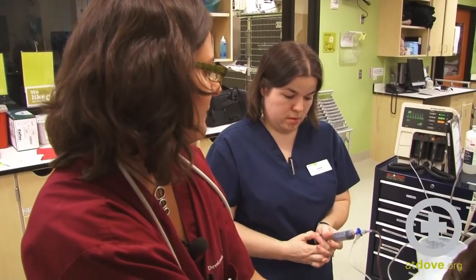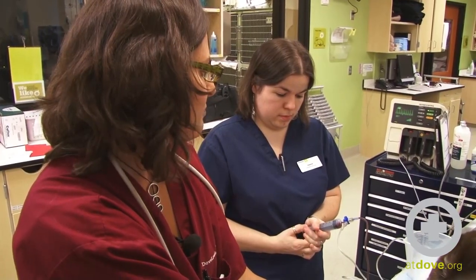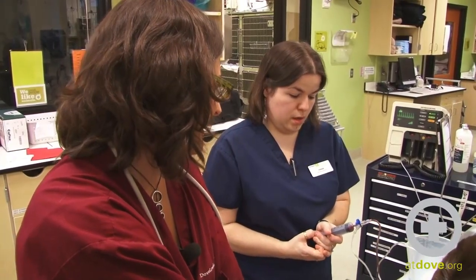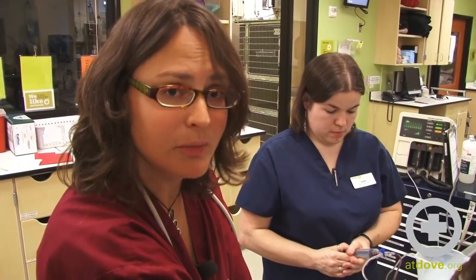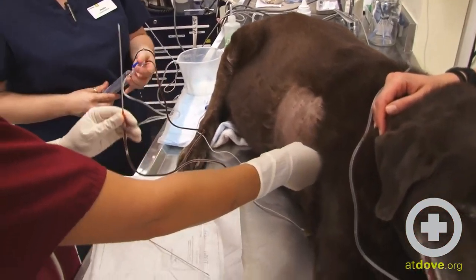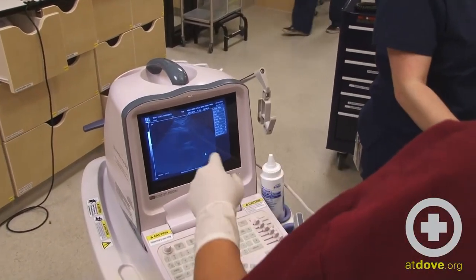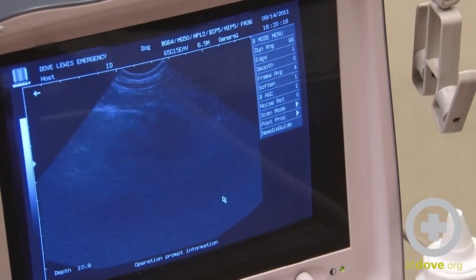Once you get a sample of fluid, certainly saving it for cytology and culture is something you can do. Most importantly, get a sample immediately and put it in a red top tube and make sure that it's non-clotting hemorrhage. If you get clotting hemorrhage, there's a chance that you may actually be in the heart, which is obviously where you do not want to be. I'm going to do another T-FAST to examine the pericardial sac to see if indeed we've removed some of the effusion. Here's the heart, and now there's substantially less effusion present — down to almost minimal.